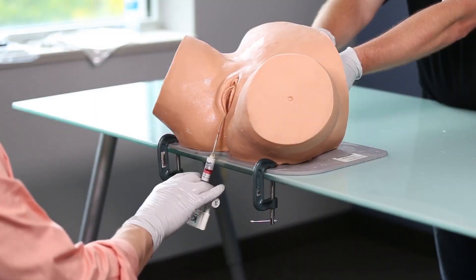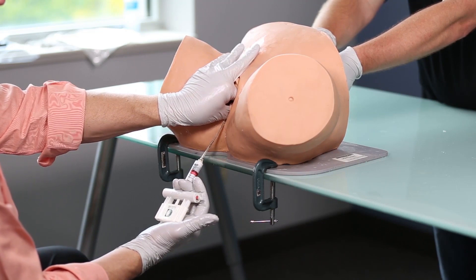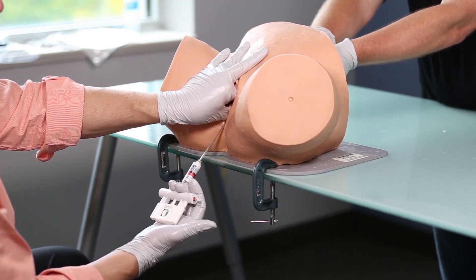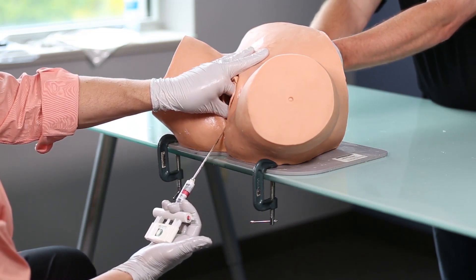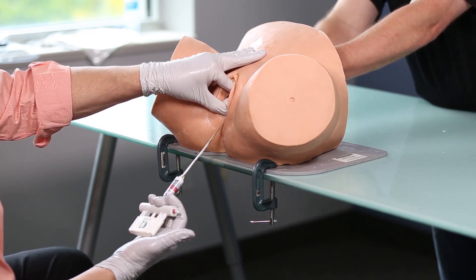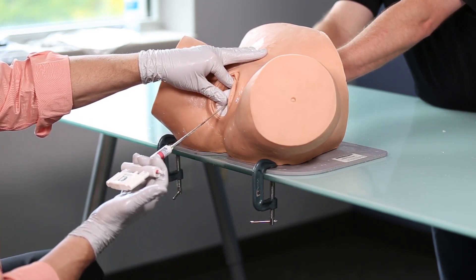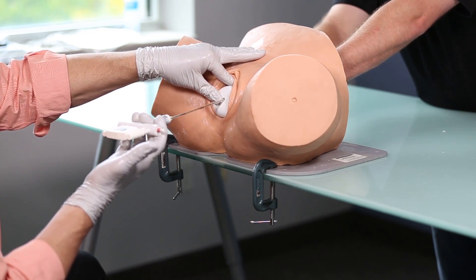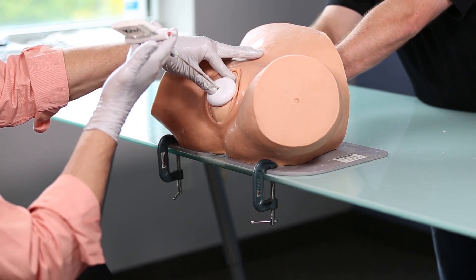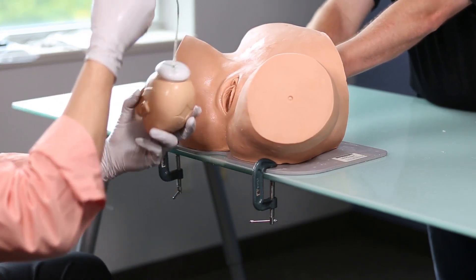Step number five is to place the thumb on the cup and the index finger on the baby's head to prevent the cup from coming off and to provide counter traction during pulling efforts. As mom begins to push, we provide traction in a downward angle — in this baby who is right occipital posterior. As the baby gets further down in the pelvis, notice the direction of pull changes, until the baby reaches the perineum. You can see where the cup was placed.